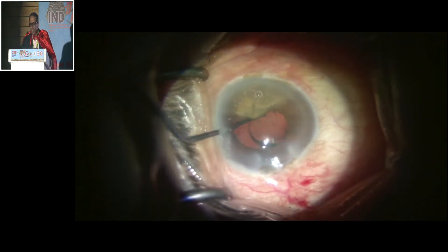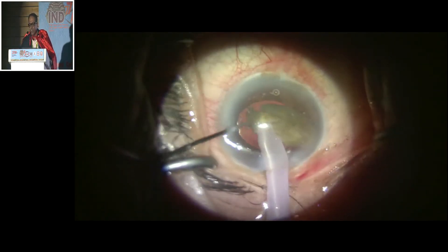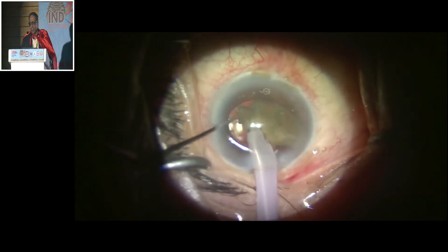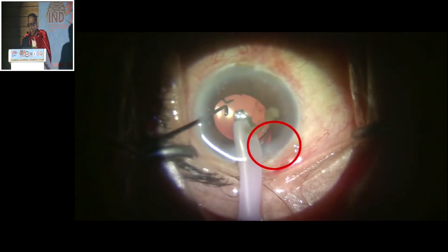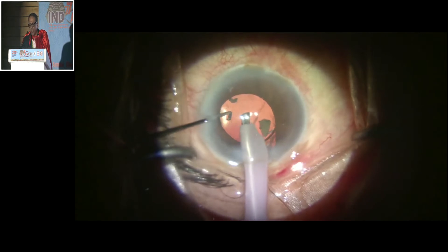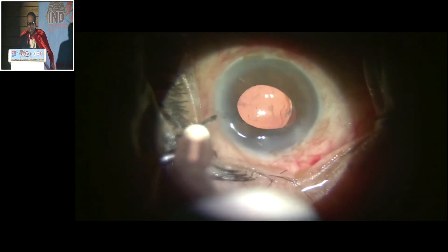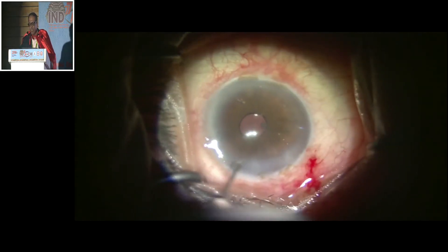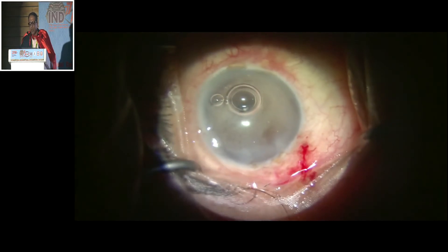I position it here, and after positioning it, I can now emulsify. In this case, a nucleus has been used as a scaffold. I note that there is a peaking of the pupil, so I keep away from that point so that vitreous doesn't come. I use the repositor to take care of the vitreous strand, then use Pilocar and triamcinolone to stain the vitreous.